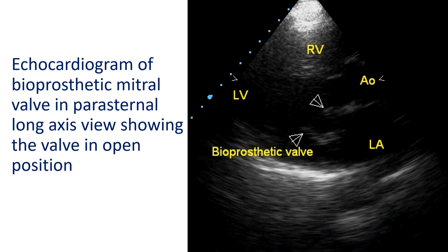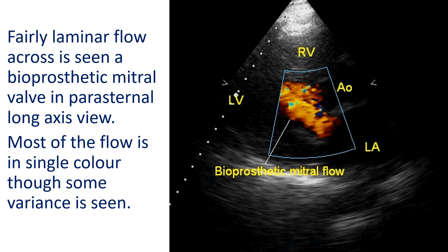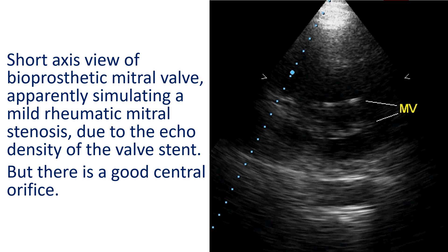Stentless valves have a larger orifice than stented valves. This is the short axis view of the bioprosthetic mitral valve, apparently simulating a mild rheumatic mitral stenosis due to the echo density of the valve stent, but there is a good central orifice.